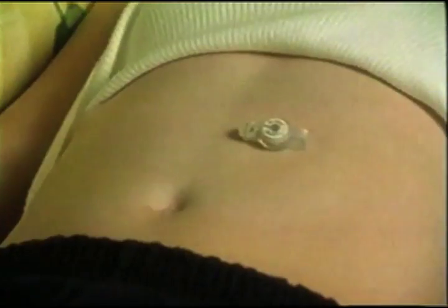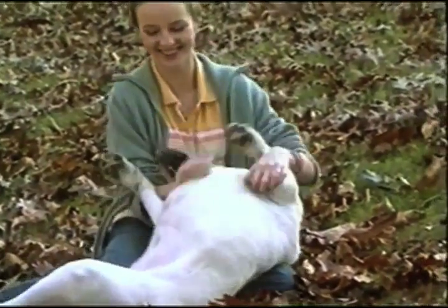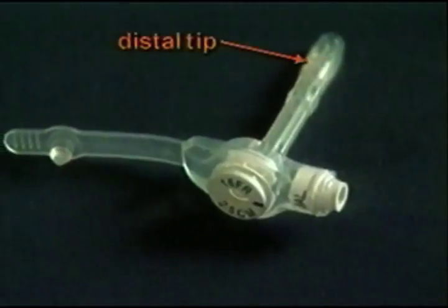The Mickey feeding tube has many features that are important and worth noting. Let's take a look at some of those features. Low profile means that the Mickey tube is designed to lie very close against the patient's body. The size of the stoma and tube are carefully matched by the doctor for a proper fit, which minimizes restriction on activity. This is the distal tip.